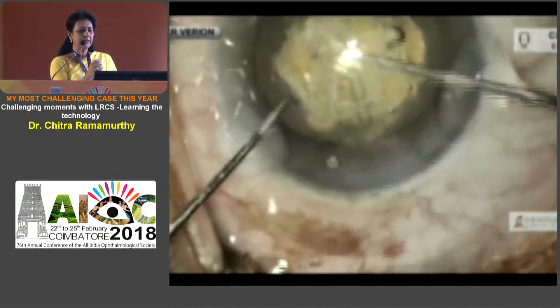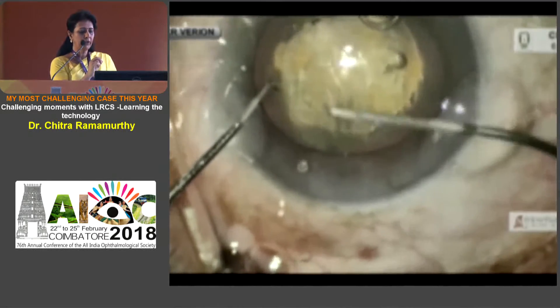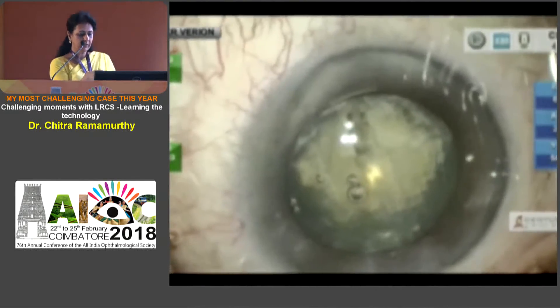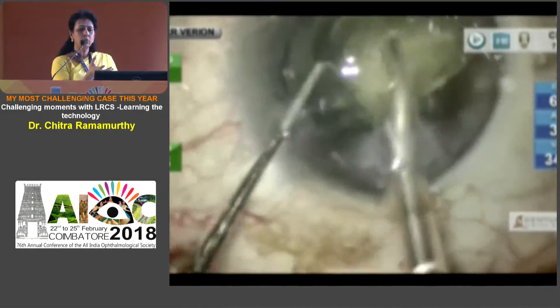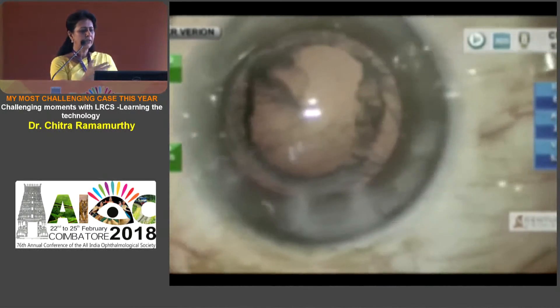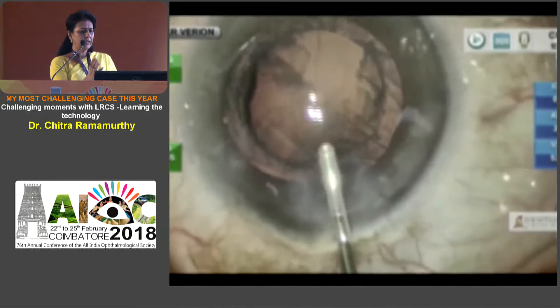This was the second case. I normally just bunch up a free-floating rhexis, but in this case I needed to use my rhexis needle to get it. It was a very soft cataract — softened and segmented — and literally in a flip mode, it all came off.